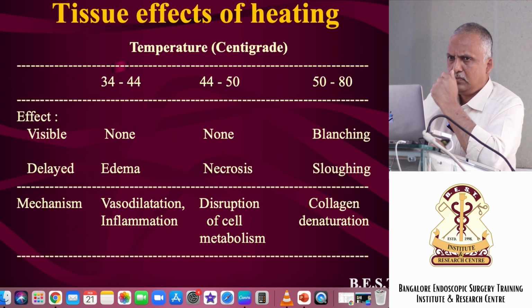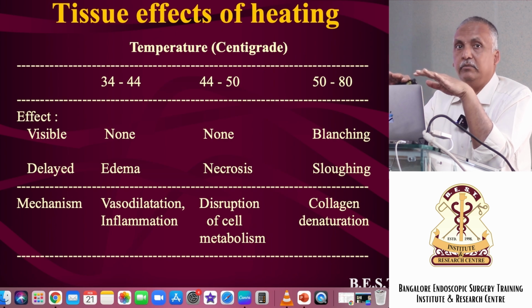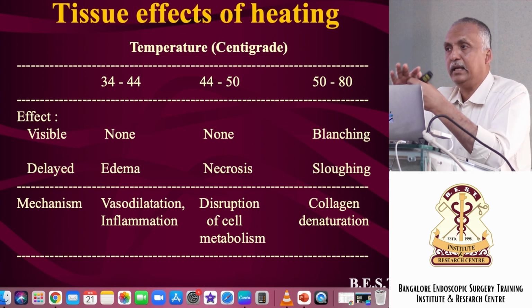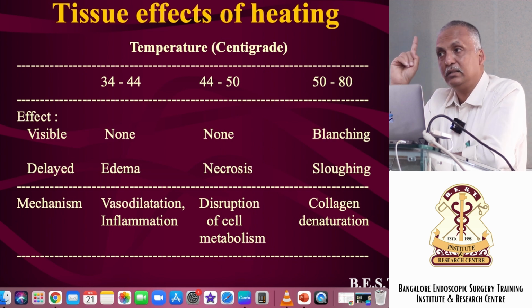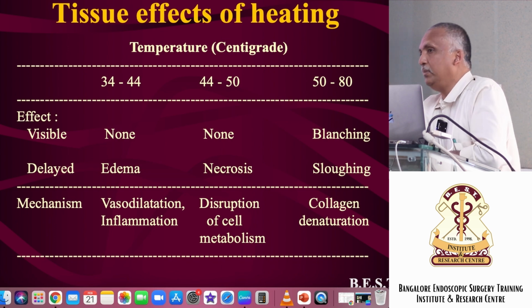Now let's talk about, we are not talking about electricity at all. We are talking about temperature. What does temperature do to the body? We are using electrosurgery only to give a thermal effect on the tissue. So, how much thermal effect will cause what biological effect?